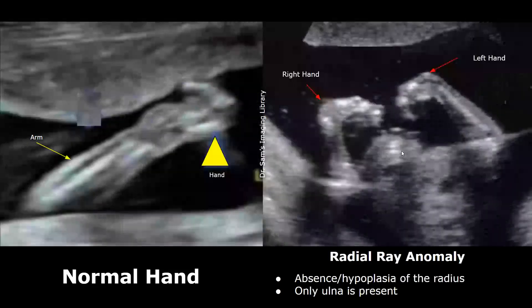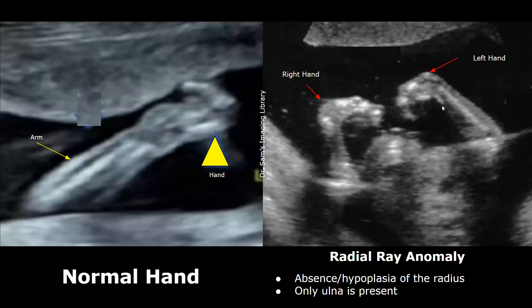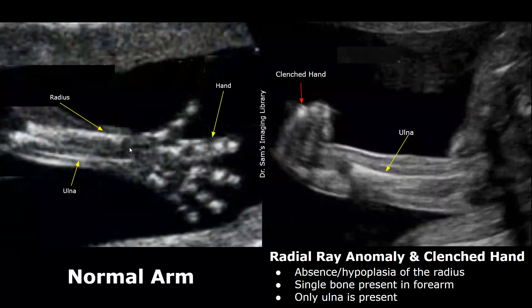Radial ray anomaly refers to absence or hypoplasia of the radius — the radius may be absent. In this image, along with clenched hands, we see absence of the radius with only one bone present in the forearm. Whereas in the normal image we will see two bones, the radius and ulna. This image shows radial ray anomaly and clenched hand, with only a single bone present in the forearm and an abnormal folded appearance of the hand. Usually the radius is absent when a single bone is seen in the forearm.